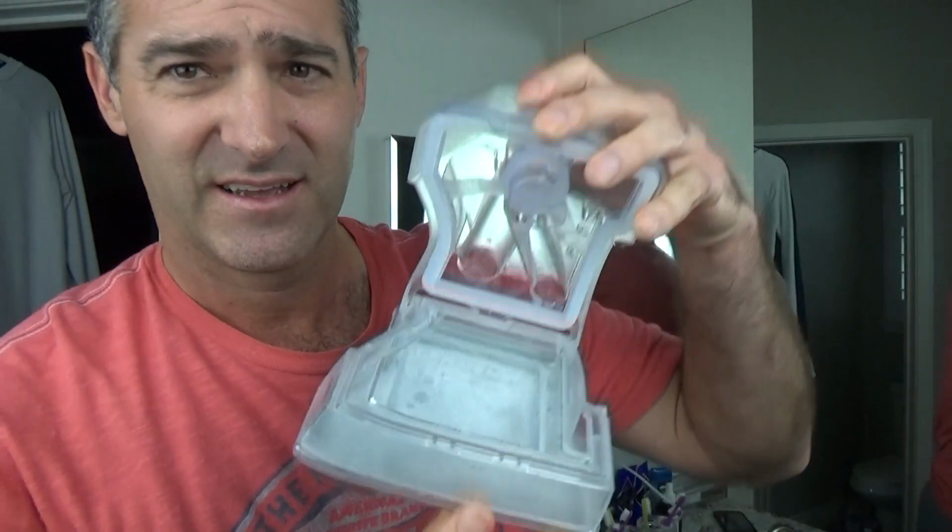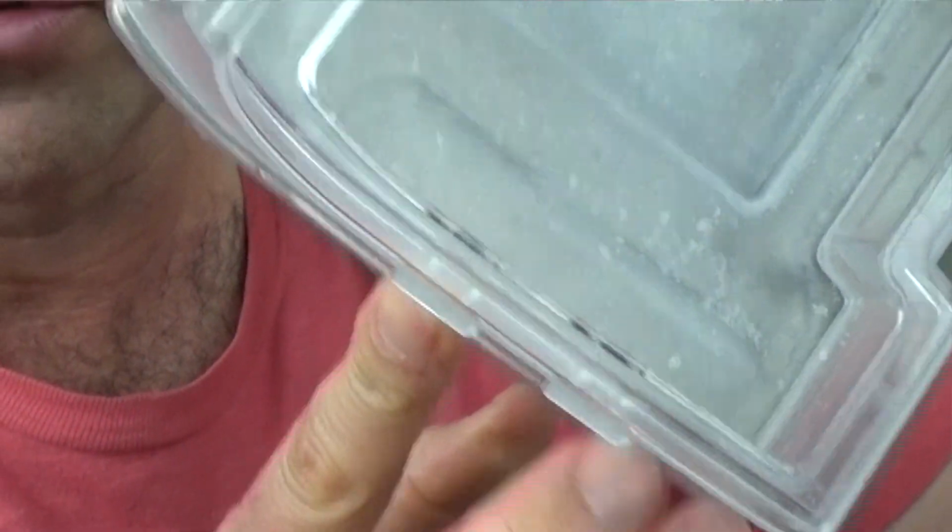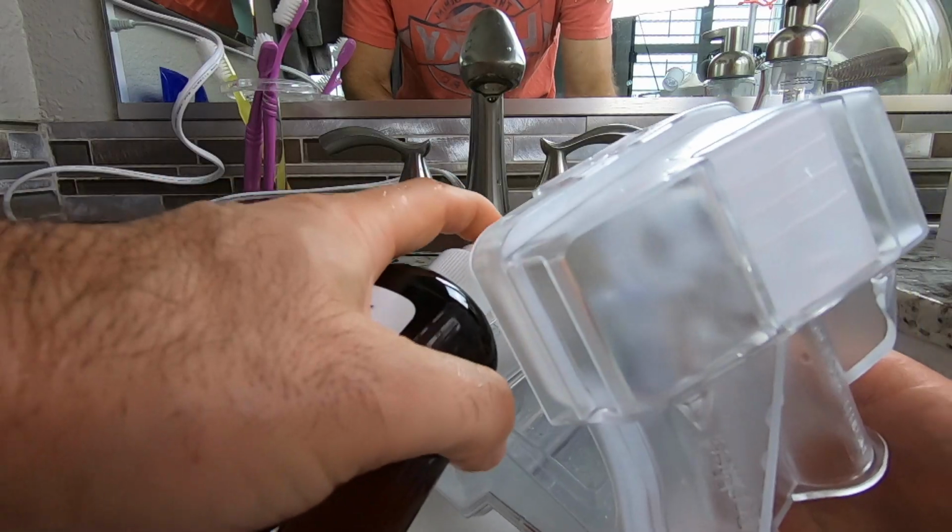Okay, last thing is a humidification chamber. And as you can see, oh, that is schmutzy, that is gross. I don't use distilled water. A lot of this is tap water. I also use refrigerated, filtered water, but there's a lot of crap in there. I'm gonna go ahead and clean it out now.